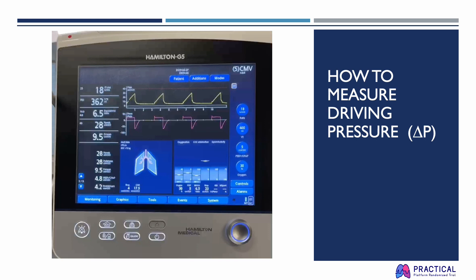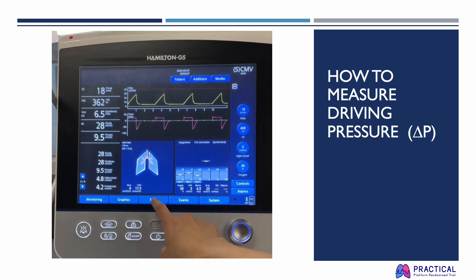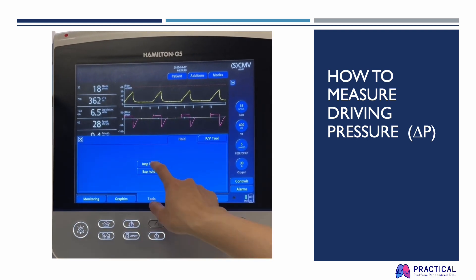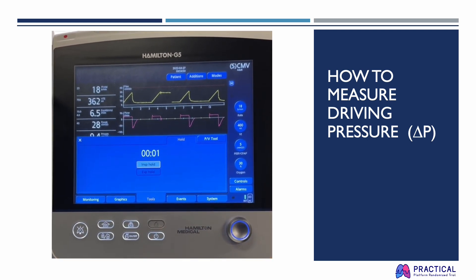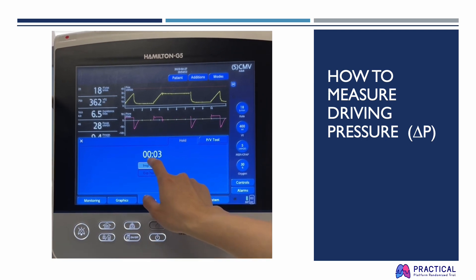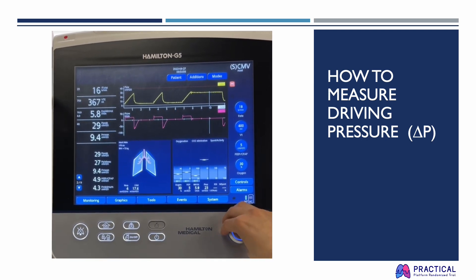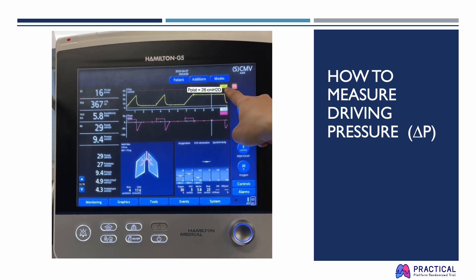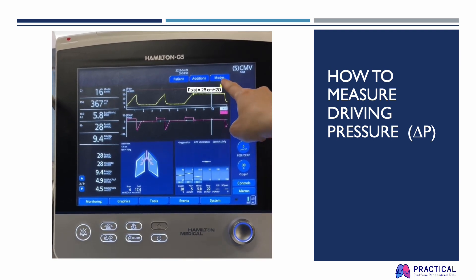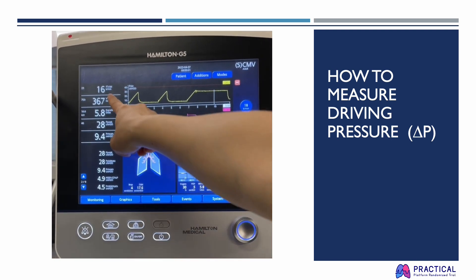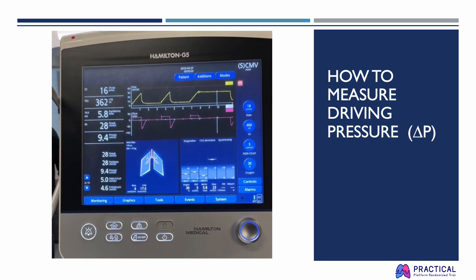This video shows how to perform inspiratory and expiratory occlusion maneuvers on the G5 to get plateau pressure and total PEEP. To measure plateau pressure, go to Tools and then press Inspiratory Hold. Wait 3 seconds and look for a straight line on the pressure-time waveform to determine your plateau pressure and volume during this maneuver, as you will need these values to calculate ERS.